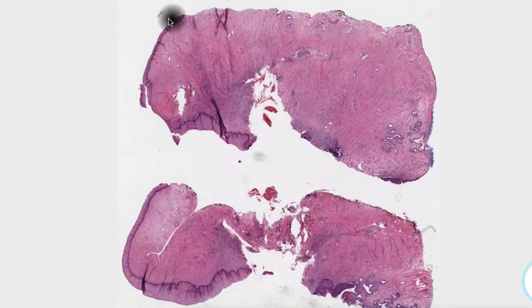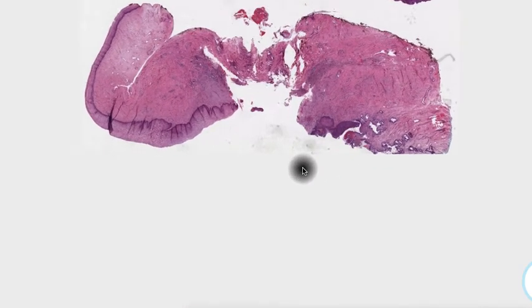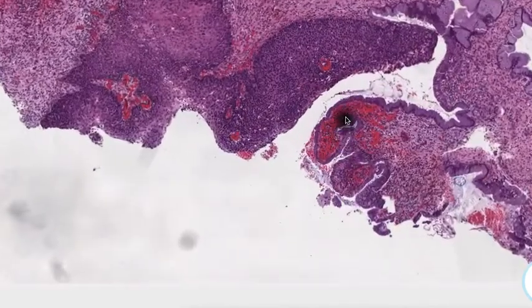So here we see the digital slide. We see a normal squamous mucosa out here on the edges. We see some inflammation here. And then down here, we see an area of increased blue staining. So that's always a good marker for something that's different. And as we go here to higher magnification on this particular area, let's just check off the list here.